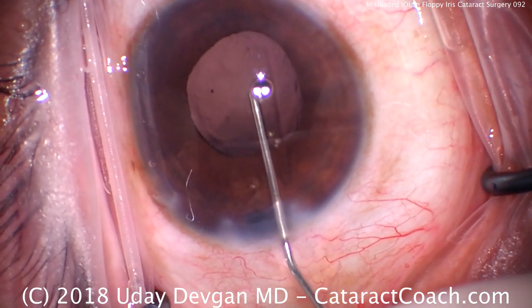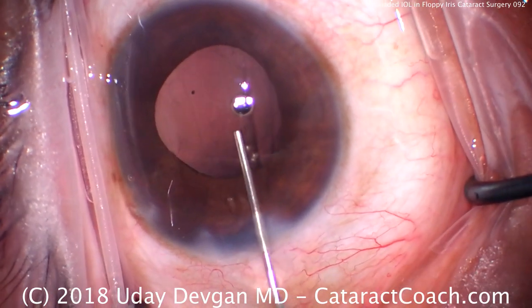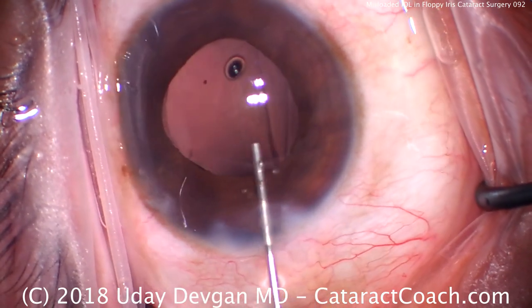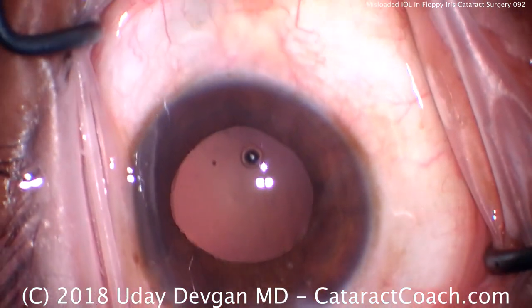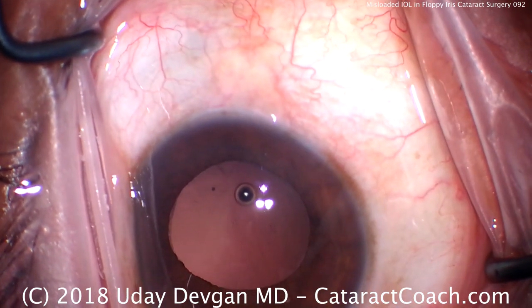This is cataractcoach.com and it's an interesting case where I have a lens that's misloaded. We're expanding the capsular bag with viscoelastic. It's a floppy iris case and you can see we had a smaller pupil, but now with the viscoelastic it's a little bit larger.